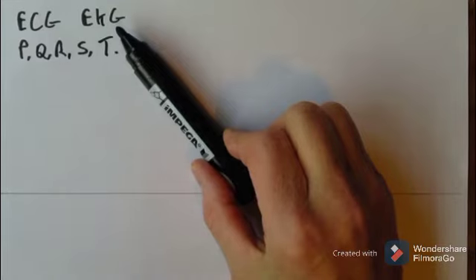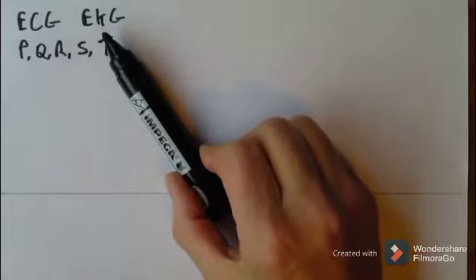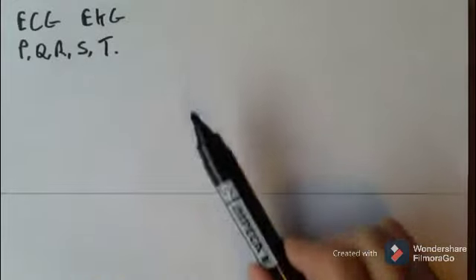So in the States there's a tendency to refer to EKG. In the UK we would call it an ECG. But it's exactly the same thing. The K actually comes from the German for cardio, because I think these machines were invented in Germany. And also the K is consistent with the original Greek as well. So whichever you call it is fine.